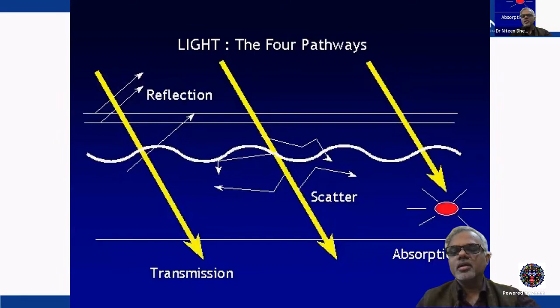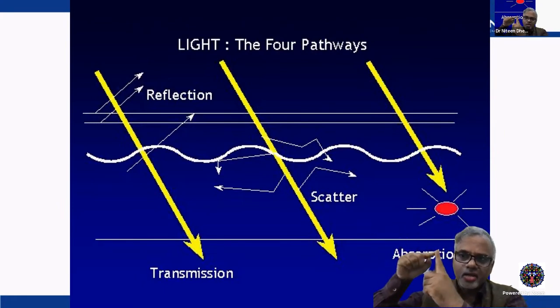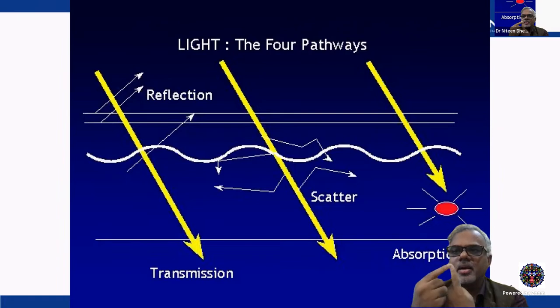So what happens if the light enters the skin? That's called the photobiology of skin. Something is transmitted through and through. If you take a laser pointer and fire on your finger, you can see the red light coming out of the nail.